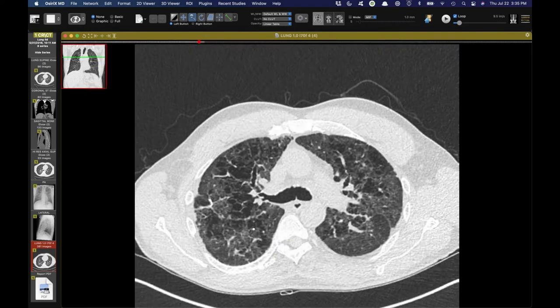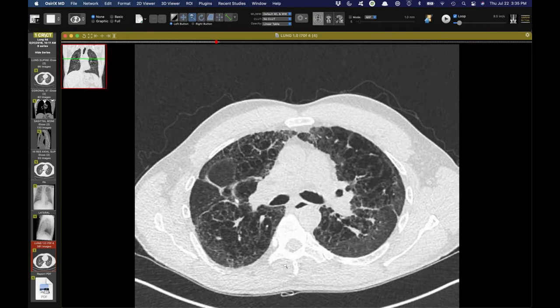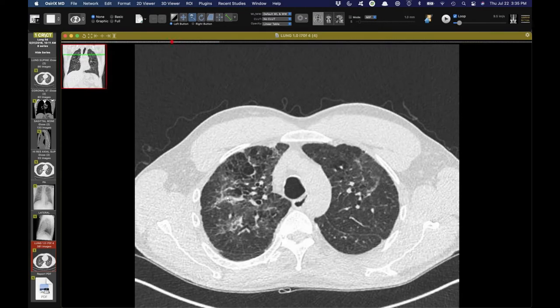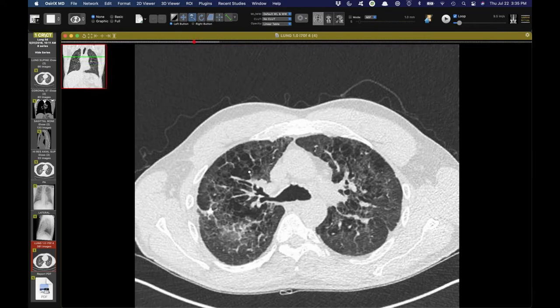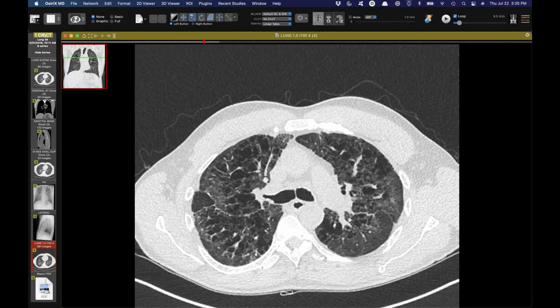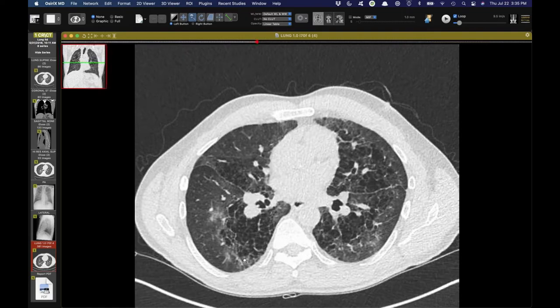He's had a surgical lung biopsy in the meantime. You can see a staple line there, and I'll show you the results because I think they're kind of interesting. When I first looked at this, I was wondering, could this be some form of emphysema or even Langerhans? Were these cystic spaces? But the more I looked at it with the volume loss, I was wondering if a lot of this is paracicatricial emphysema. There's a little bit of bronchial dilation.